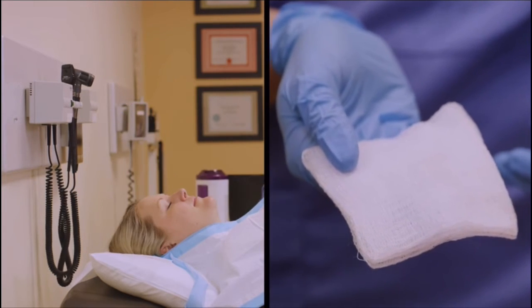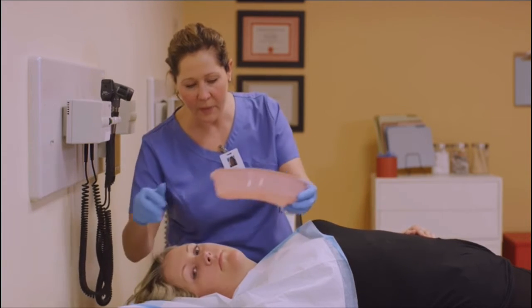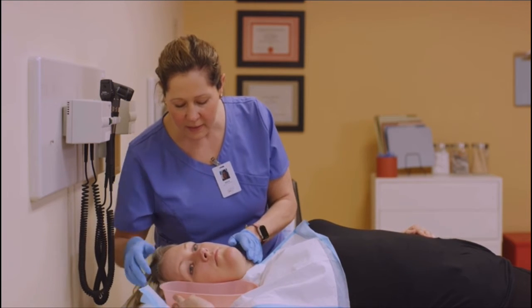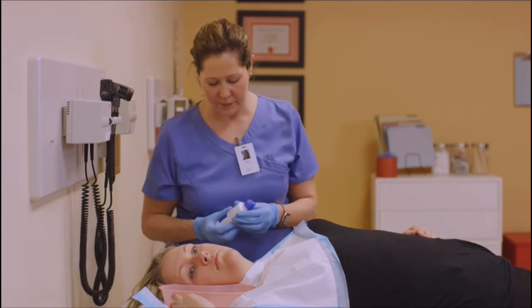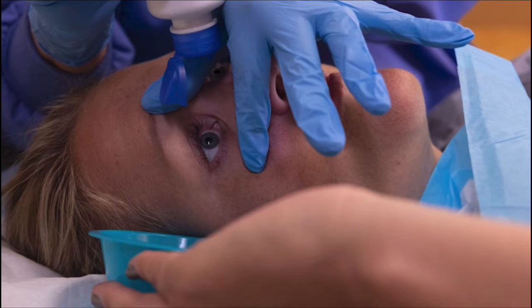Have the patient turn their head to the side during irrigation. Place a collection basin below their eye and ask the patient to hold the basin tightly against their face and to keep both eyes open looking straight ahead, focusing on a non-moving object. Using fingers on your non-dominant hand, pull upward on the patient's upper lid and downward on the patient's lower lid. Hold their eye open and maintain this position throughout the irrigation.